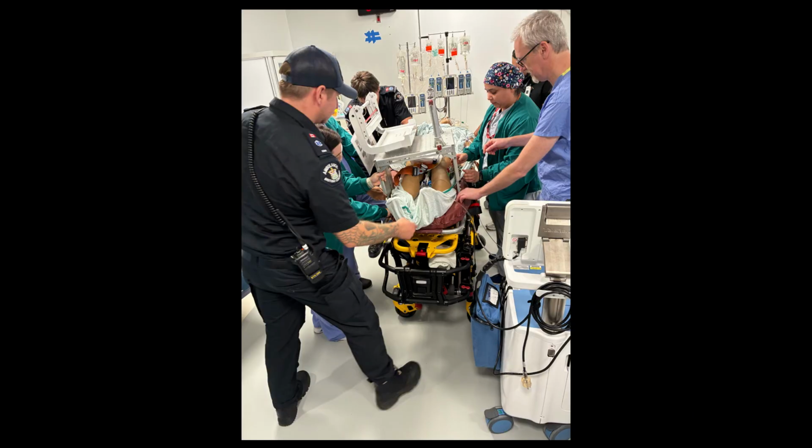After the patient has been moved to the stretcher, begin to secure the pack rack. The pack rack needs to have at least 1 foot sitting on the stretcher's metal frame, not the purple leather fabric. The white monitor securement device should be over the right leg of the patient to ensure that you can visualize the monitor in the ambulance.